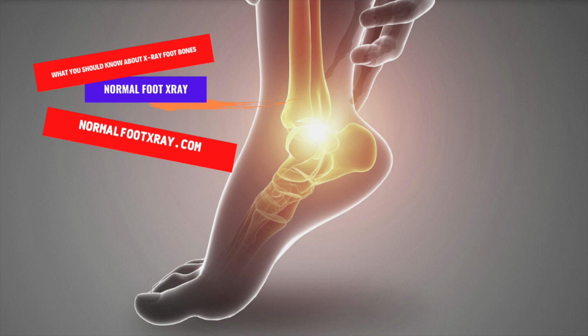An oblique X-ray is another way to view the phalanges and interphalangeal joints. In addition, it provides a second look at the calcaneus, which is an important part of the foot. The doctor can determine whether a fracture is present or not by analyzing the navicular bone with an oblique X-ray. A lateral X-ray can also be helpful in assessing a foot fracture.